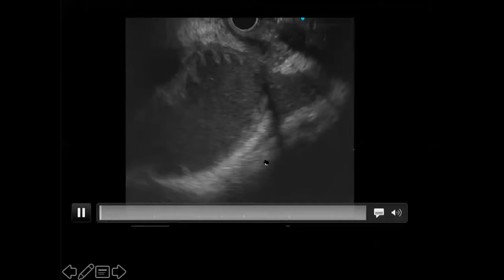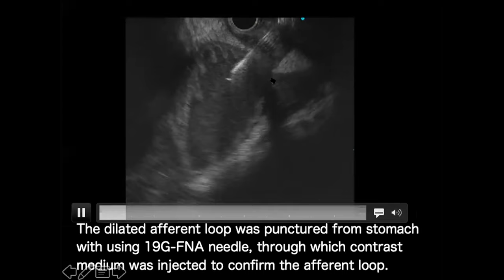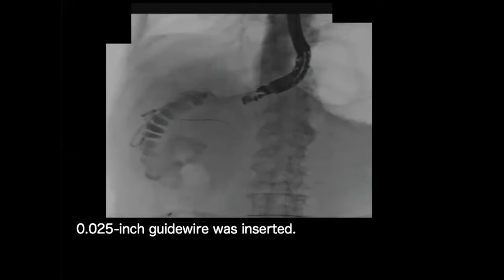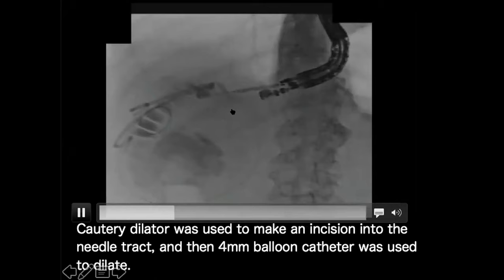The dilated afferent loop was punctured from the stomach using a 19-gauge needle, through which contrast medium was injected to confirm the afferent loop. A guide wire was inserted. A cautery dilator was used to make an incision into the needle tract, and a 4 mm balloon catheter was used to dilate it.